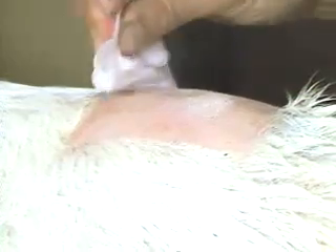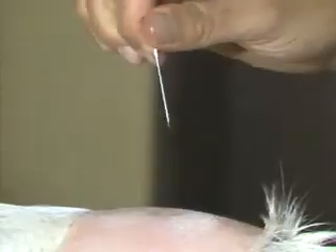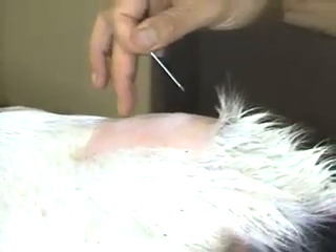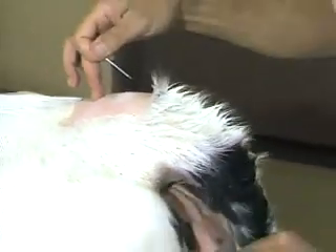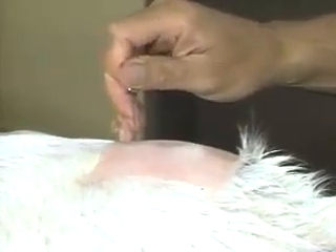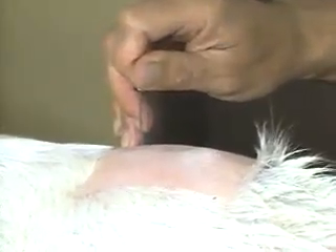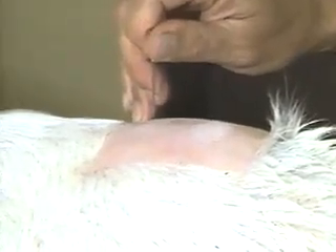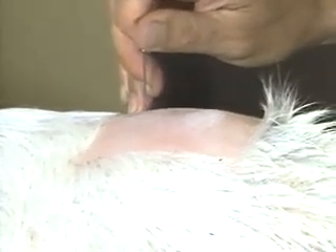The area is prepped with alcohol. Take an 18-gauge, preferably a one-and-a-half-inch needle — it could be done with a one-inch needle. It's helpful to identify the site one more time with a finger. Keep the bevel of the needle either directly anterior or directly posterior, and the needle goes in nearly perpendicular, but maybe slightly anterior-directed, precisely on the midline, and thrusted in.